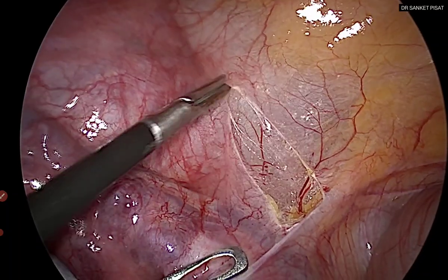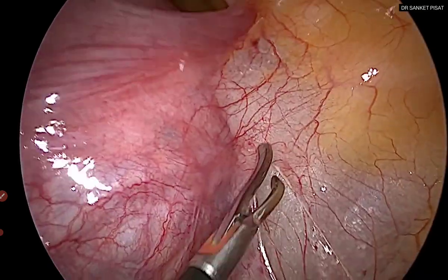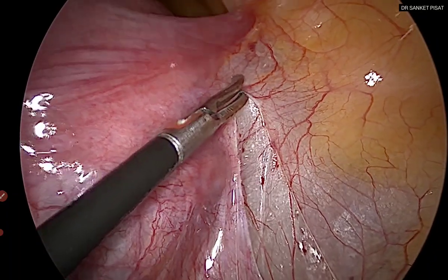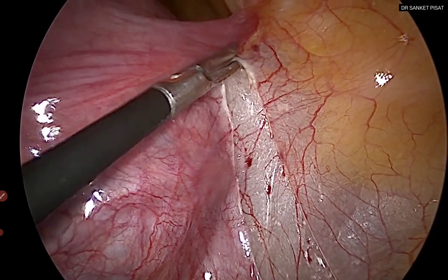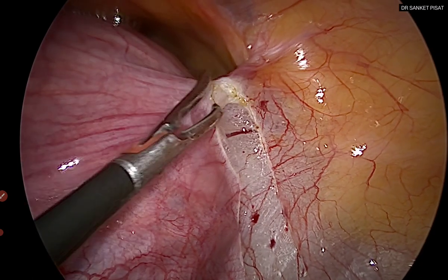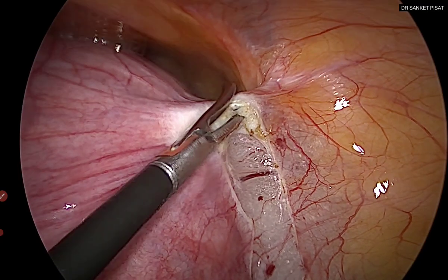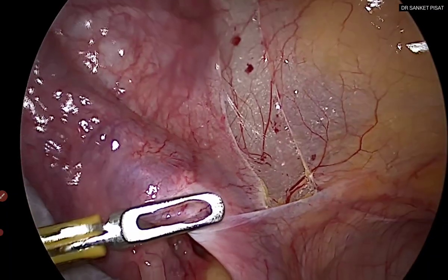Do not try to prematurely look for any structure — just try to incise the peritoneum from the infundibulopelvic ligament all the way up to the round ligament. This gives you more space. The clear areolar tissue seen below the incision signifies that we are in the correct plane. This areolar tissue also contains blood vessels, and it is a good idea not to dissect it forcefully because otherwise there will be bleeding.